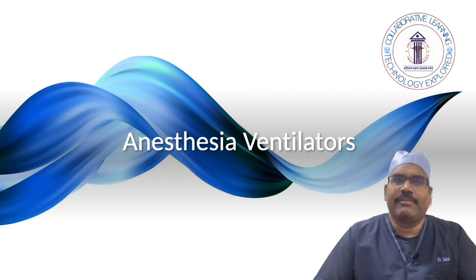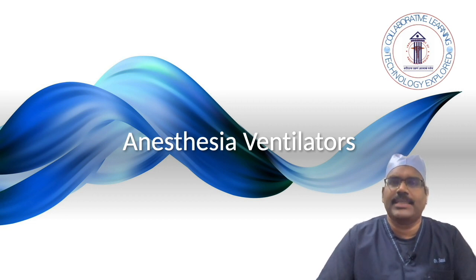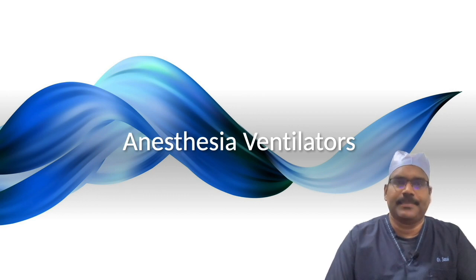Today's anesthesia workstation ventilators incorporate ICU-like capabilities, including a variety of ventilation modes and the ability to allow for patient triggering. While ICU ventilators are simply open circuit, using entirely the fresh gas for each breath and venting all expired gas into the atmosphere, the anesthesia workstation must incorporate a means of collecting and re-delivering the patient's exhaled gas in a semi-closed circle system. This requirement presents unique engineering challenges in the design and control of anesthesia ventilators.